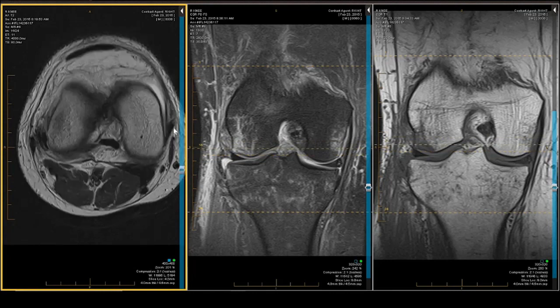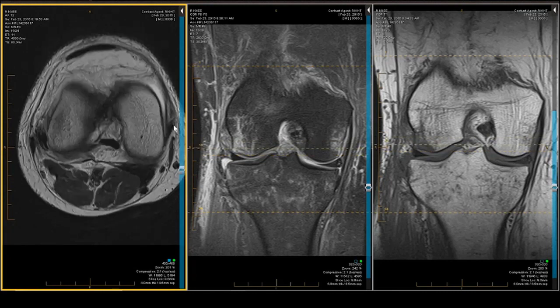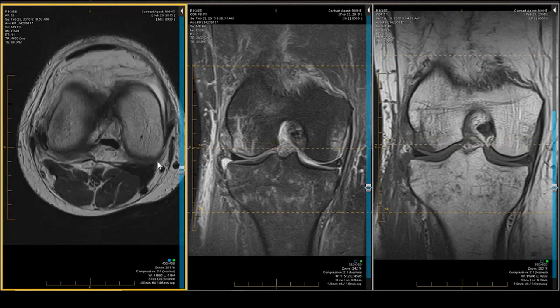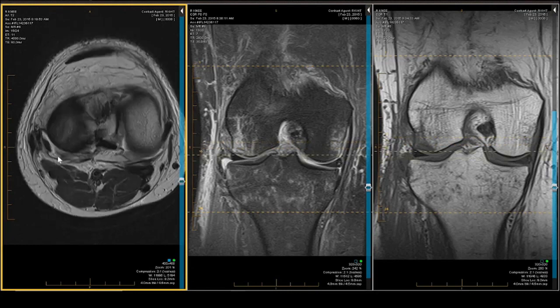Let's get oriented. This is the medial side — you can see the middle layer of the MCL standing out quite nicely. Behind it is the POL, the posterior oblique ligament of the knee, and that transitions into the OPL, which goes across the knee over to the opposite side.